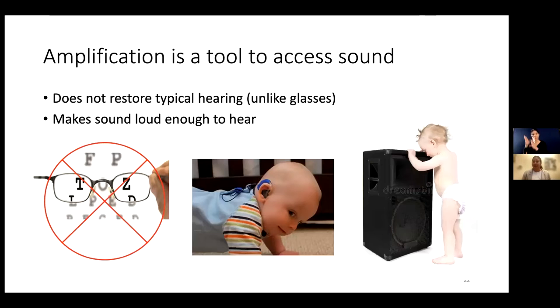Also important to keep in mind is that your child is still hearing sound through a speaker. So when we think about just the quality of sound when it's coming through a speaker, that's a very different quality of sound than when you're speaking or listening to somebody in real life. So there's that additional layer of sound quality on top of this distortion that is important for us to keep in mind when having realistic expectations of what we're thinking our kids are hearing.